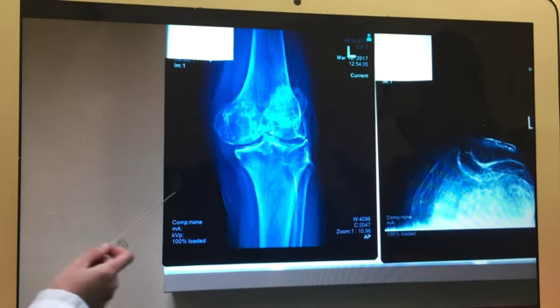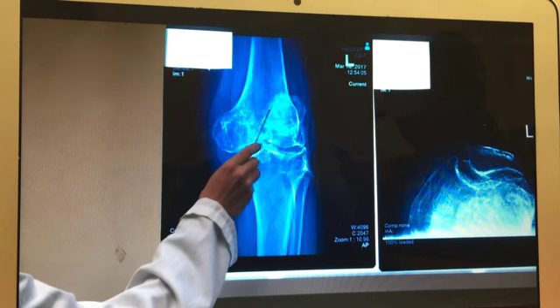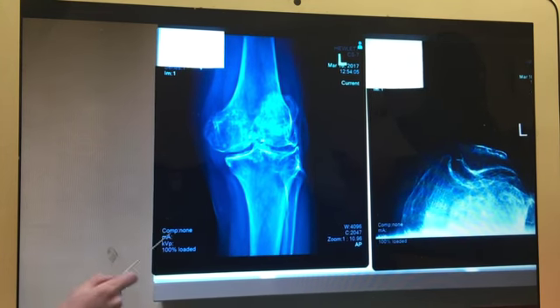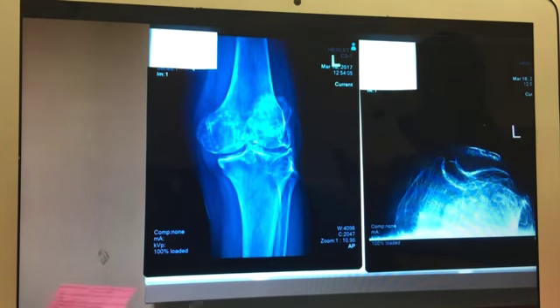So, what I should have done for this radiograph is to check the borders of the patella to make sure that they're centered over the femur. But the tech did take this radiograph because the joint space is open.